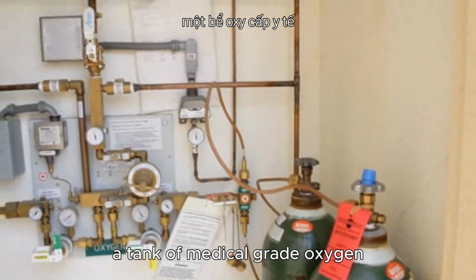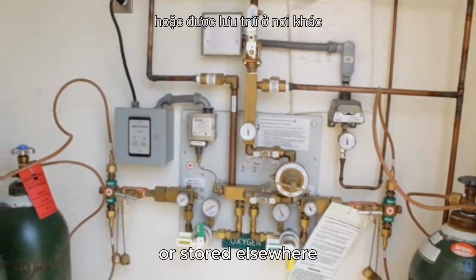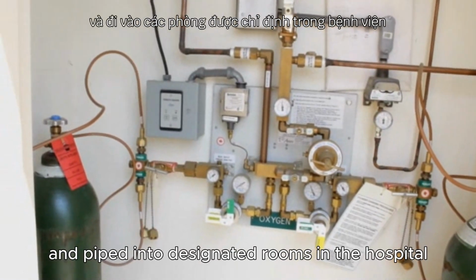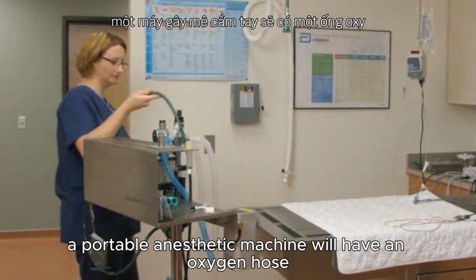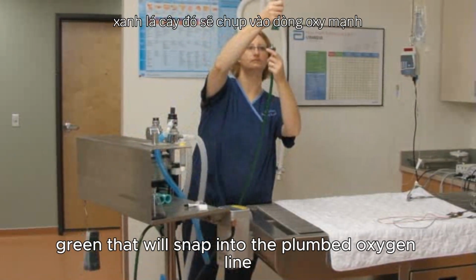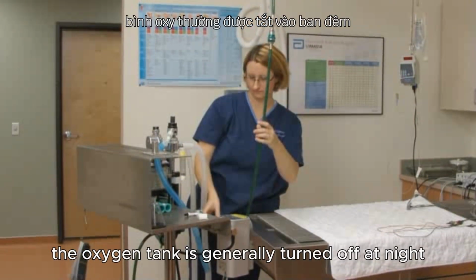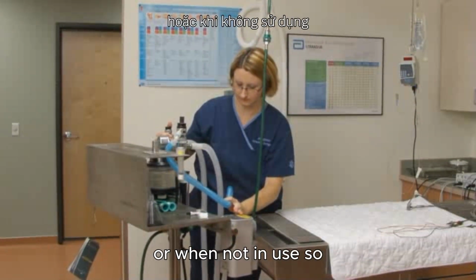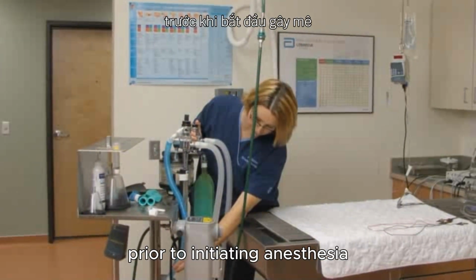A tank of medical-grade oxygen can either be attached to the anesthetic machine or stored elsewhere and piped into designated rooms in the hospital. A portable anesthetic machine will have an oxygen hose, green, that will snap into the plumbed oxygen line. The oxygen tank is generally turned off at night or when not in use, so it will need to be turned on prior to initiating anesthesia.